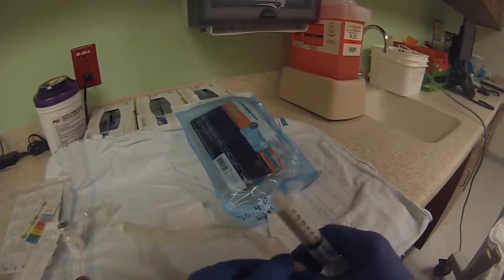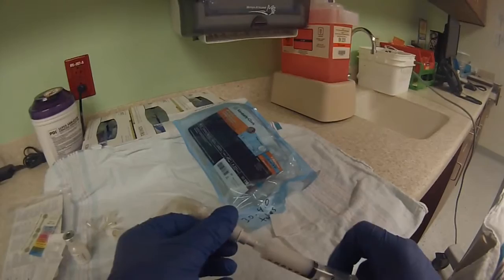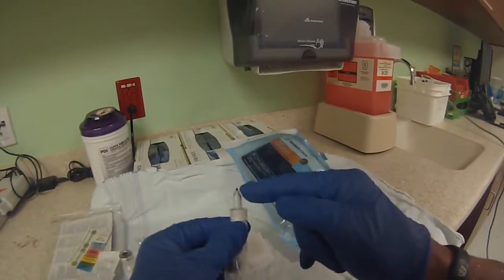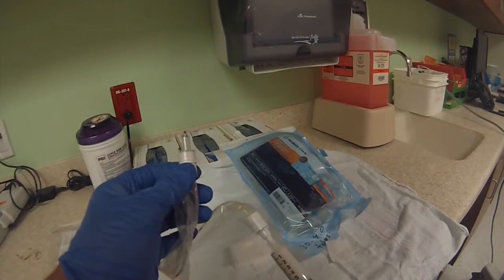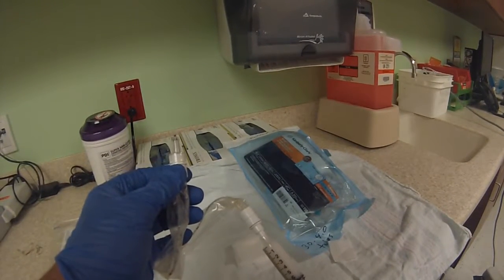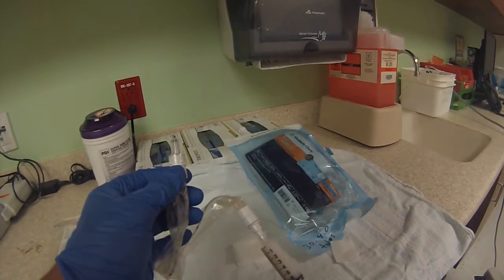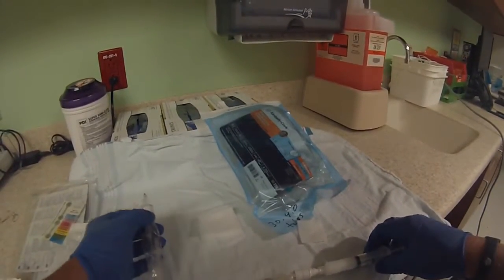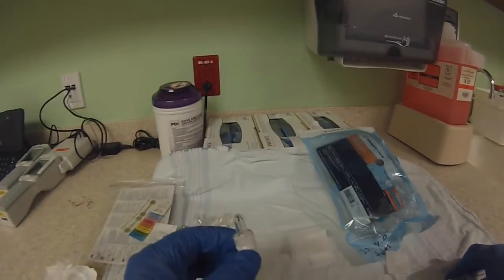So this catheter, you're going to screw this on here. You're going to push it to the end — there's the little tip right here. You want to slowly push until you see a little bit of — there it goes right there. It's primed. Pull it back so it's beyond the hub.